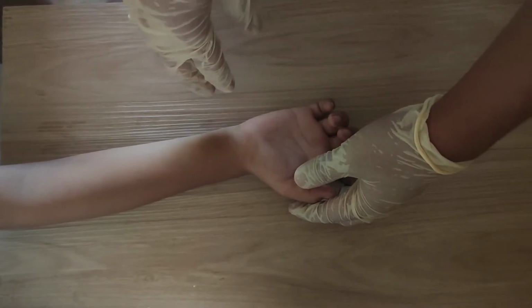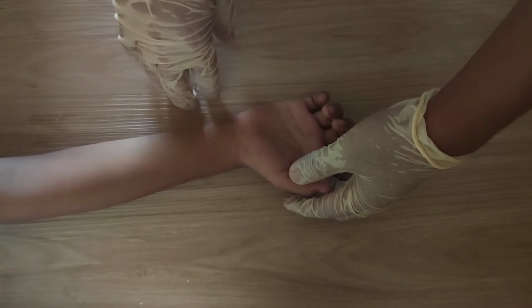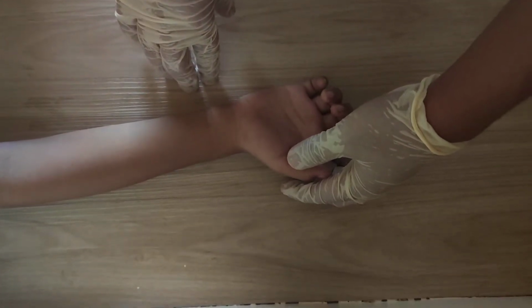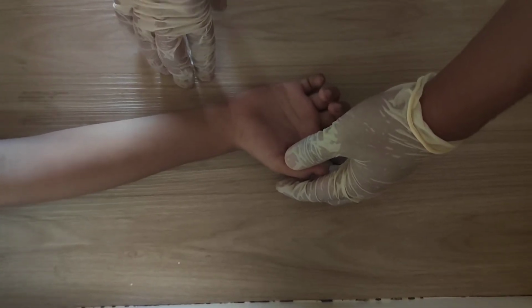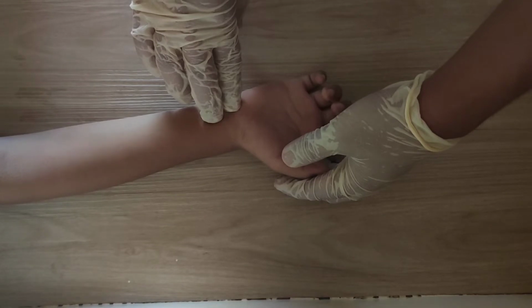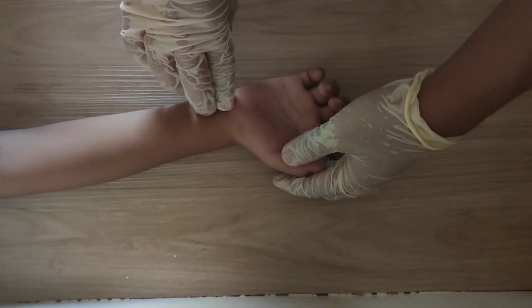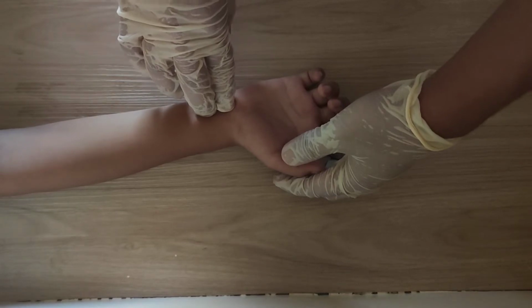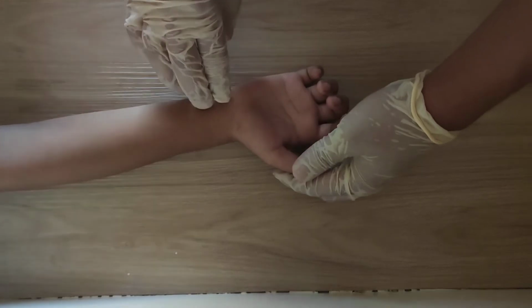For the next procedure, select the radial artery as first choice, except in the case of multiple radial artery punctures, hematoma, occlusion of ulnar artery, history of circulatory impairment to extremity, or cardiac arrest. The radial artery is a small artery, however, it is easily stabilized as it passes over a bone groove located at the wrist. The percutaneous puncture and pressure control are enhanced by the anatomical landmark.